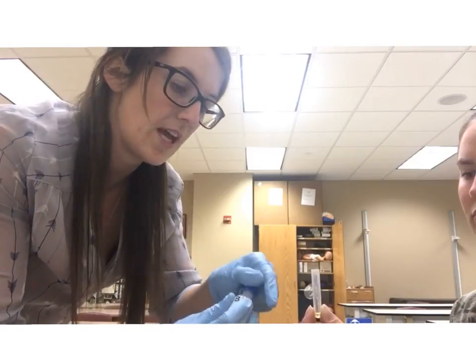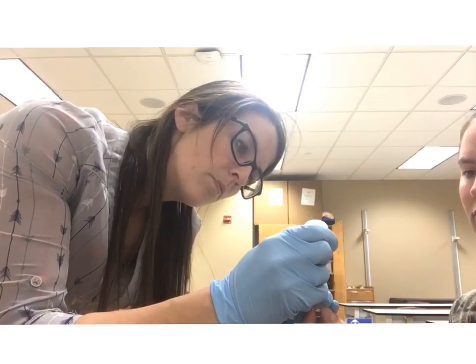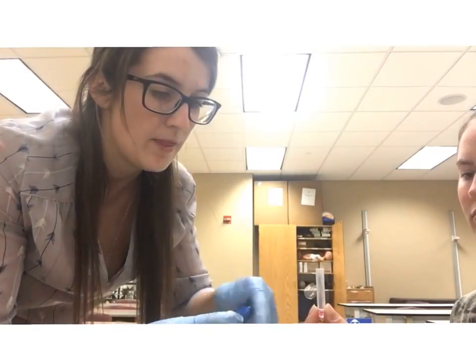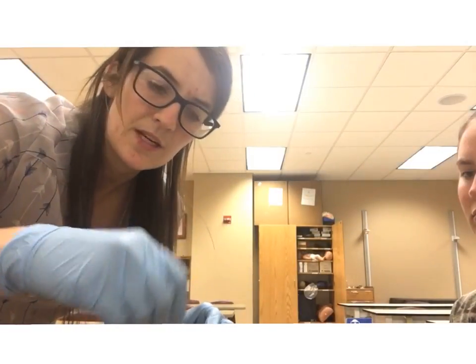You want to do this immediately before you do your test — you don't want it to sit for very long. Then we're going to go ahead and swirl that around to mix it up.